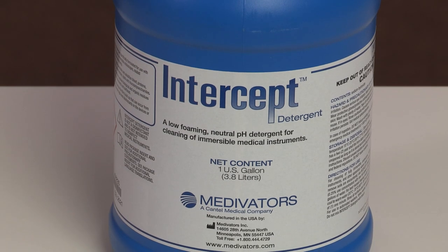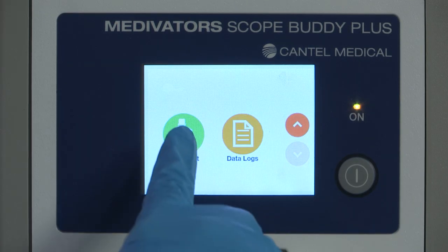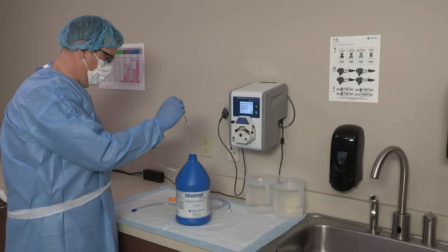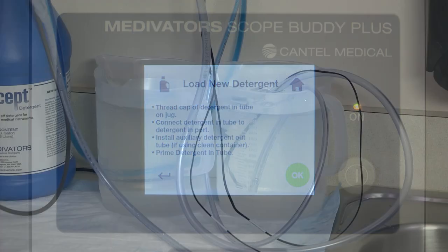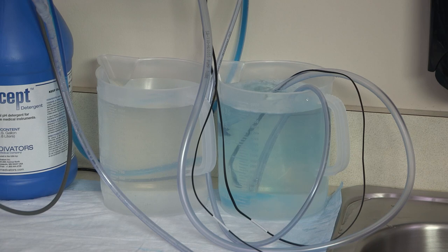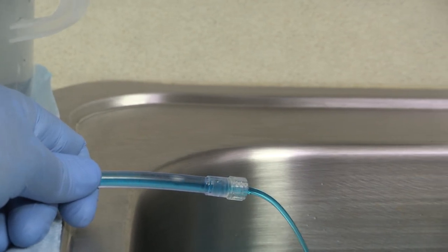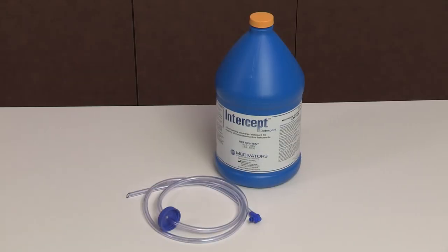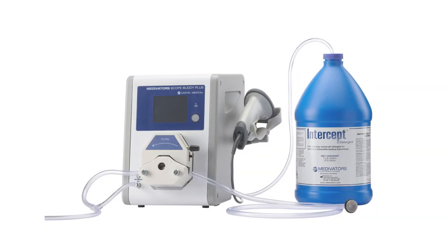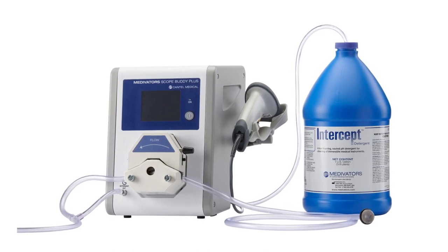The Scope Buddy Plus Flushing Aid has been validated with Intercept Detergent. Intercept Detergent is a unique surfactant-based formulation clinically proven to provide superior removal of biological and organic soils, and effectively aids in the removal of biofilm on flexible endoscopes. The concentrated solution has a fast contact time of one minute and low-use concentration. Its low foaming and neutral pH characteristics meet the criteria of endoscope manufacturers and society guidelines. Intercept Detergent is biodegradable, with a temperature range of 20 to 35 degrees Celsius (68 to 95 degrees Fahrenheit). The temperature monitoring range can be adjusted in the detergent menu; consult the detergent IFU for required temperatures.